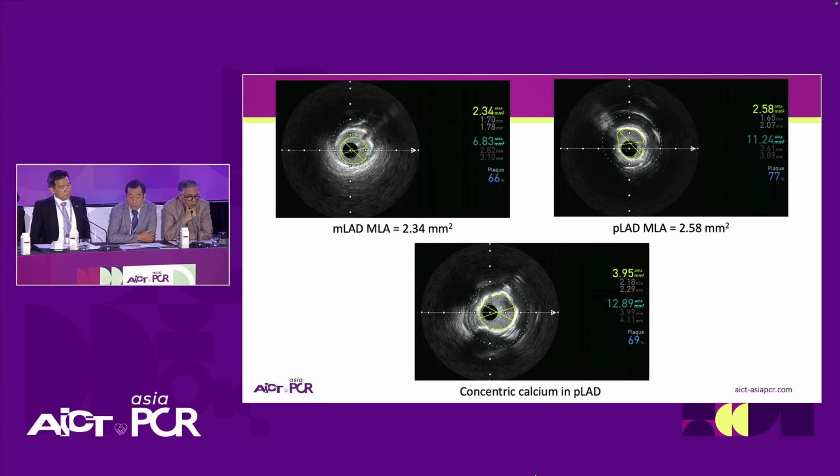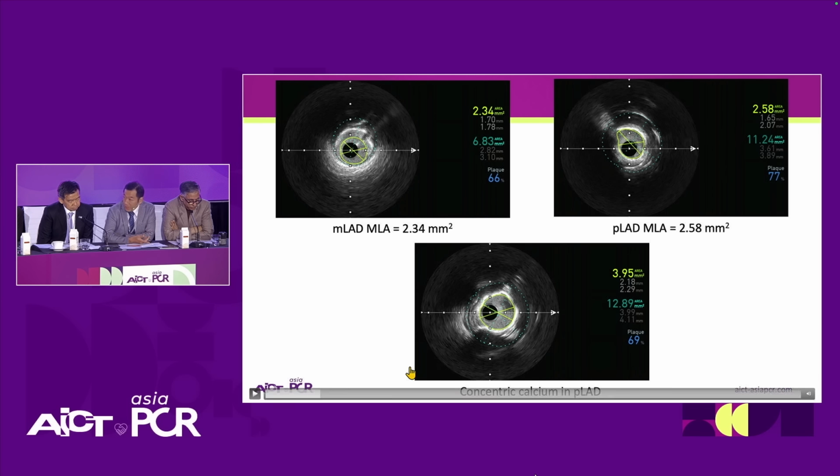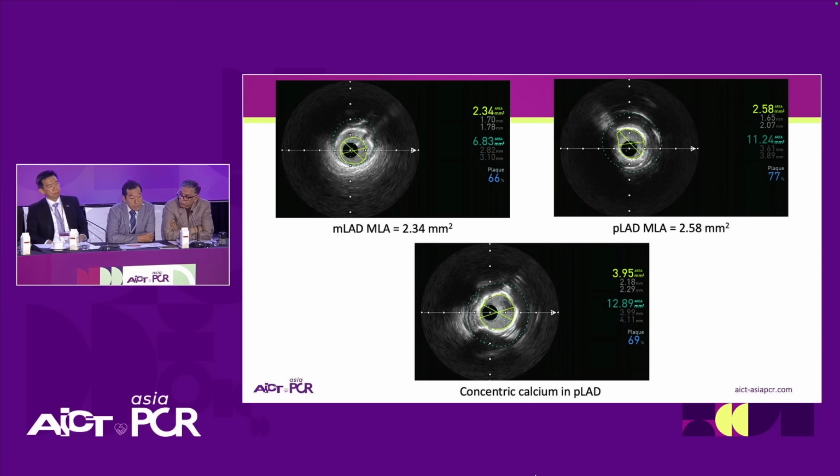So thanks, Mark, Hui-Wen, and Jason for preparing this case. So I think the strategy you mentioned just now was upfront rotor, and you have a 7 French guide, so I guess you have a whole buffet of sizes. I typically use only 6 French, so I don't have that much sizing to play around with. So maybe question to Mark, how are you going to use these findings now to decide on your burr size and why?